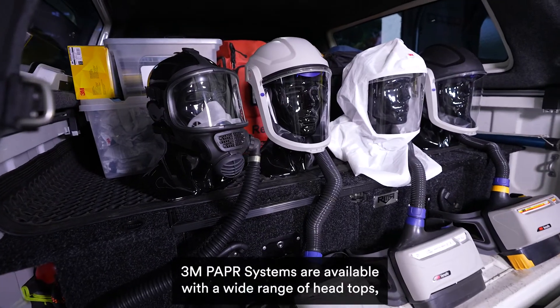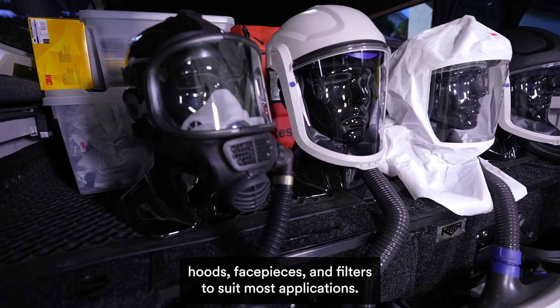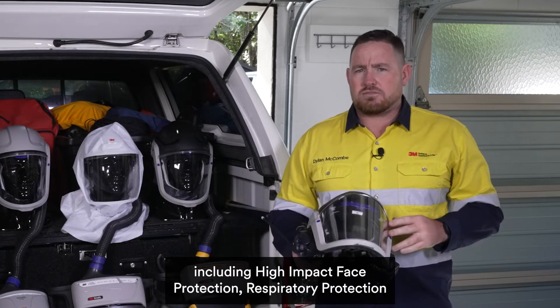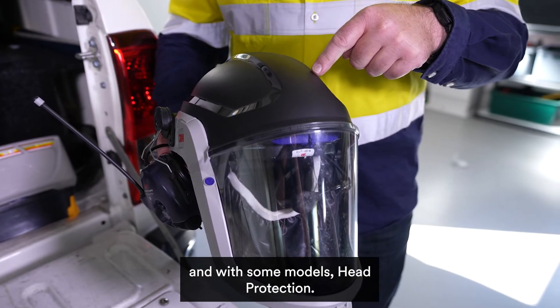3M PAPR systems are available with a wide range of head tops, hoods, face pieces and filters to suit most applications. The M-Series hard head top integrates multiple pieces of PPE including high impact face protection, respiratory protection and, with some models, head protection.